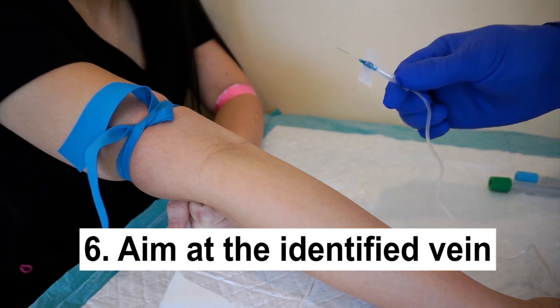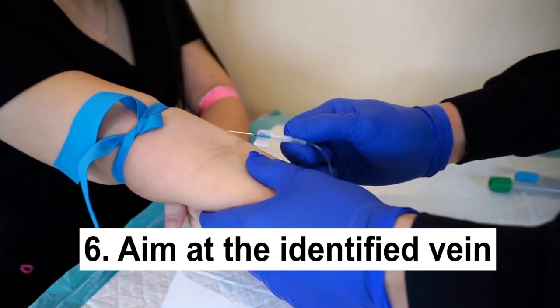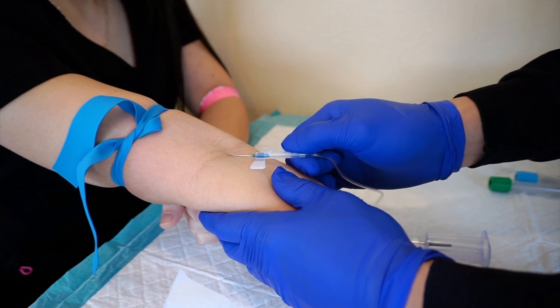Sixth, carefully handle the needle and aim at the identified vein. Keep your eye on the bevel. The bevel should be up and the pointed end of the needle is aiming at the vein.